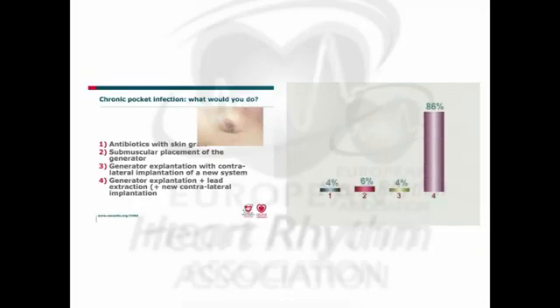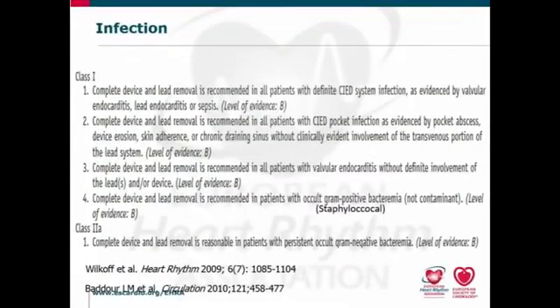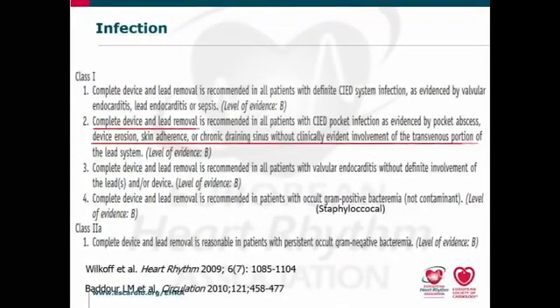Okay, 86%. That's really the vast majority, and actually that's the correct answer. According to the guidelines, complete device and lead removal is indicated in case of device erosion or chronic infections, because very often the leads are actually colonized, and if you do not take the leads out, the patient may have ongoing infection.